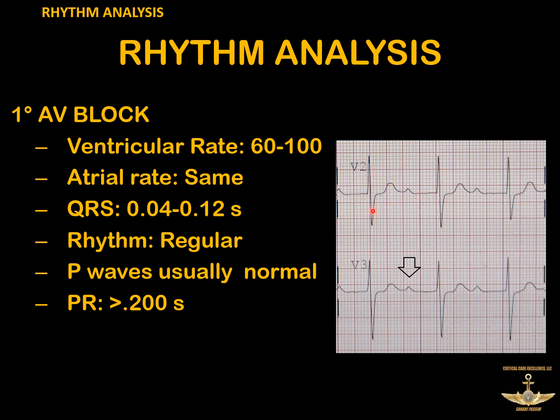Here we have the previous QRS complex. The T wave, right behind the T wave is the next beat's P wave, and then we have a big long PR interval. So there's 200 milliseconds or 0.2 seconds, and then there's 1, 2, 3, 4. So the PR interval for this is almost 0.4 seconds, so almost twice as long as it should be. And you see this is persistent, so the rhythm is regular, and every QRS complex and every P wave looks the same.